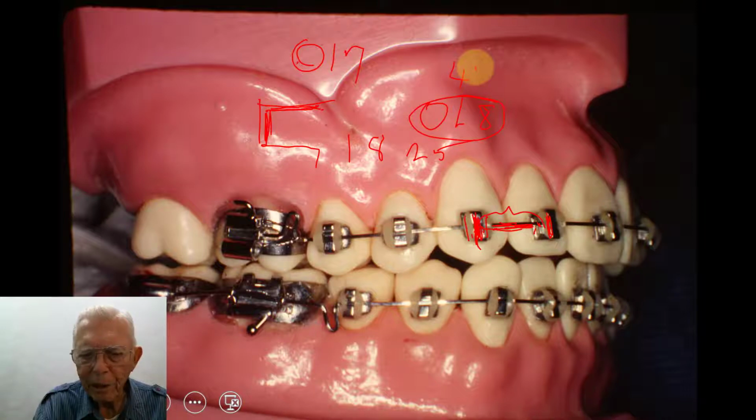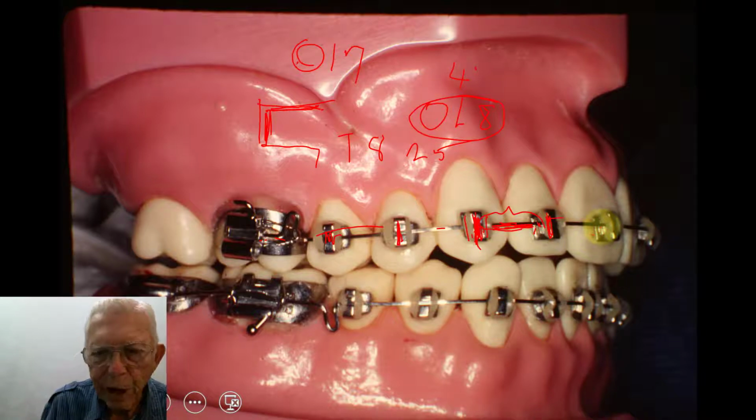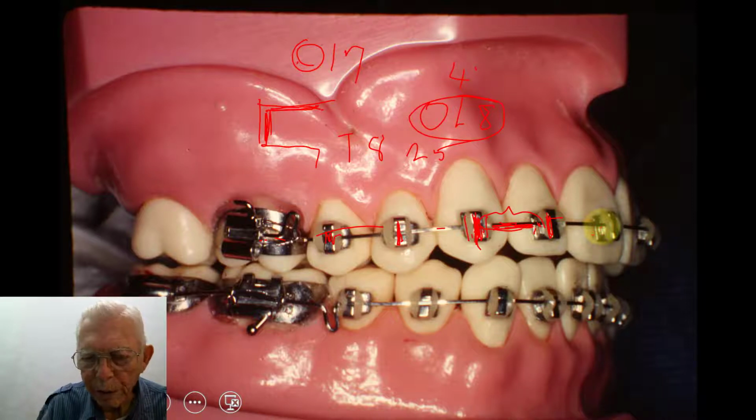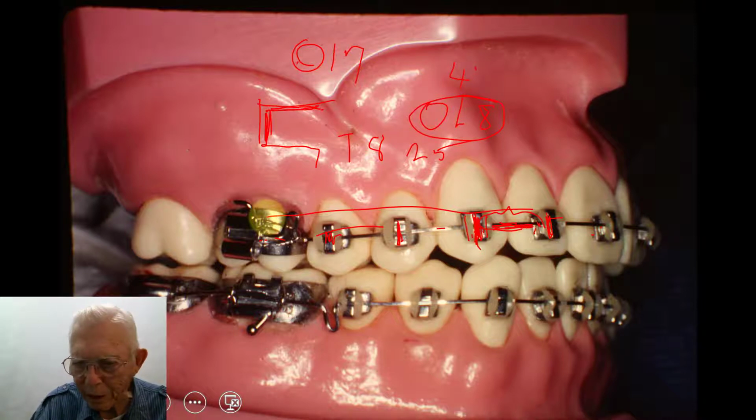Now, I like a small bracket, and you can see these brackets, and the arch wire size is small, and I can torque faster with a smaller wire than I can with a heavier wire. And we use the Big Daddy on the outside till we can do anything with it as far as bigness is concerned, and then I work with a smaller wire to do that. Now the brackets we use have a vertical slot in them, and let me go through and show you.